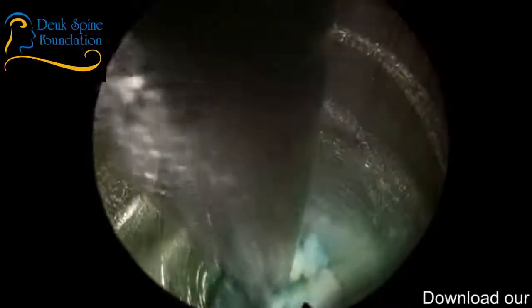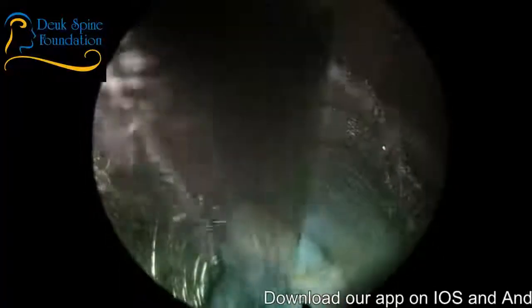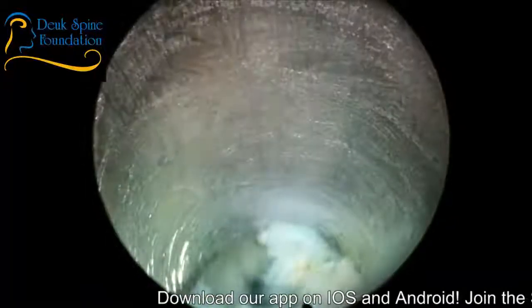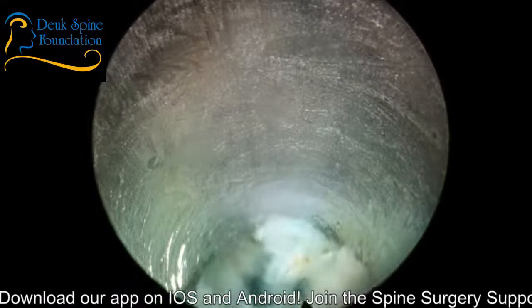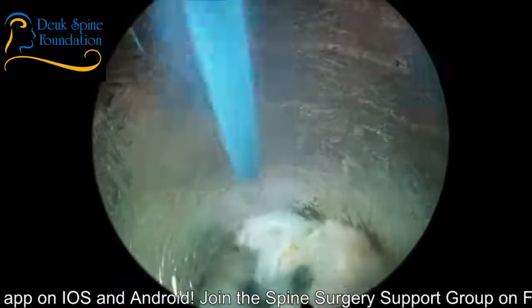Unfortunately, herniated discs, truthfully, don't usually come out in one piece. You gotta grab them multiple times and try to get them out. There you go. See? You trying to take my fingers off?